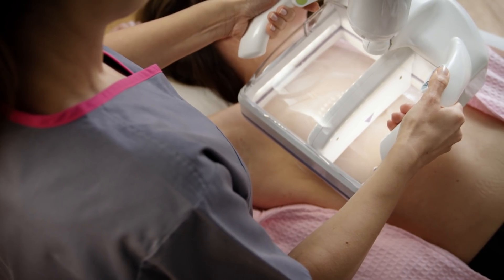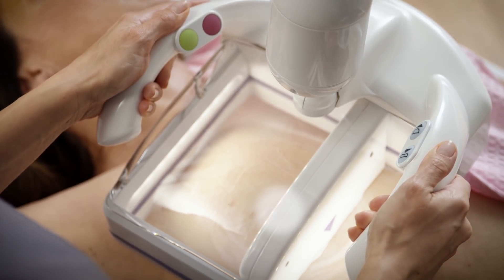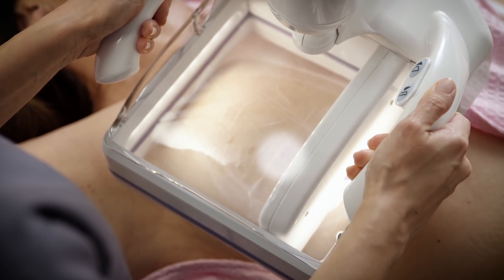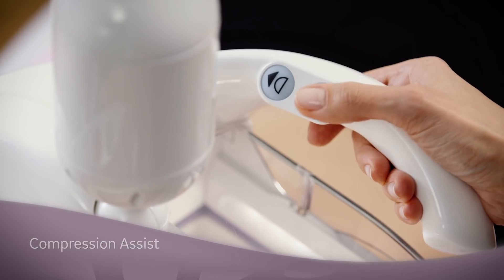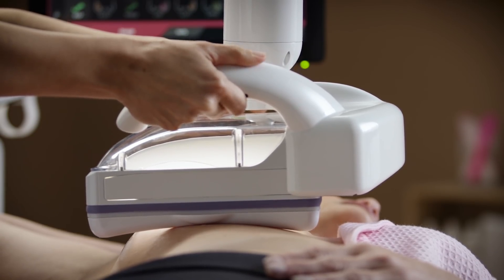The arrow on the transducer helps with alignment and positioning. Gentle pressure is applied to evenly thin the breast tissue while aligning it parallel to the skin. The compression assist feature is used to set the pressure to one of three levels, adjusted while the patient breathes normally.